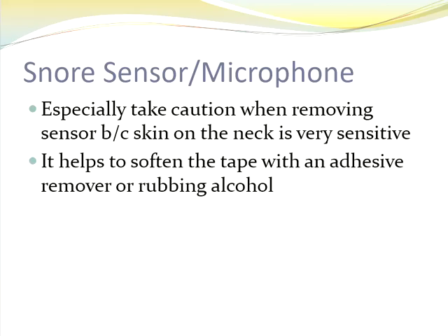The skin on the neck is very sensitive, so be very careful when you're taking this one off. Luckily, the tape that comes in your kits and the tape that most labs use is a cloth tape, which means that you can saturate it with rubbing alcohol or adhesive remover, and it'll help that tape come off very easily.